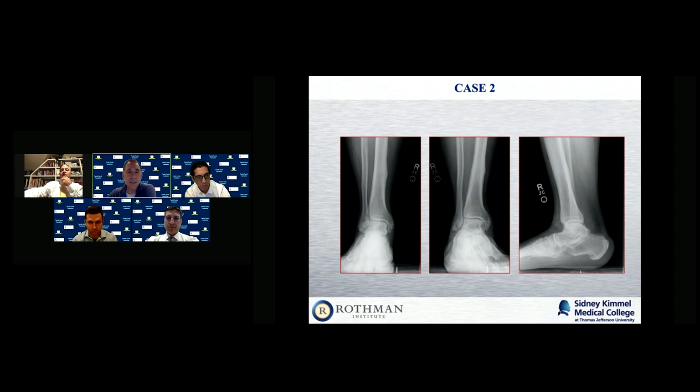Yeah, sure. Obviously we see something there on the medial talus, and it looks like he's had, just like you said, his motor vehicle crash a long time ago. Right, so it went on to heal. His overall alignment is not horrible, but he's got this significant arthritis.